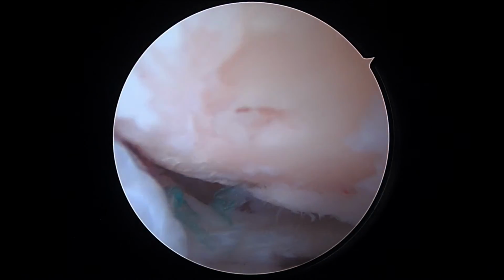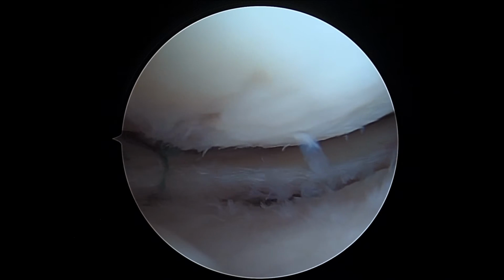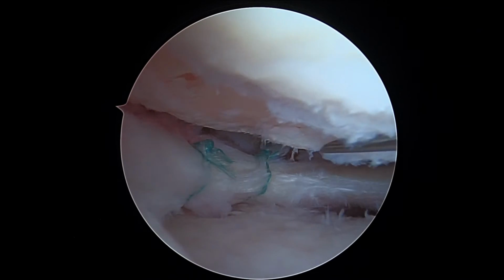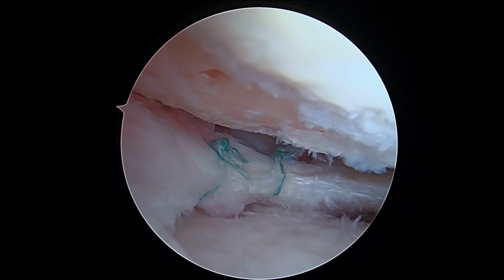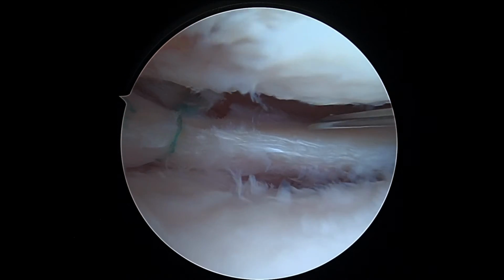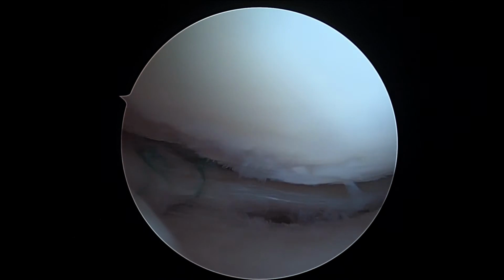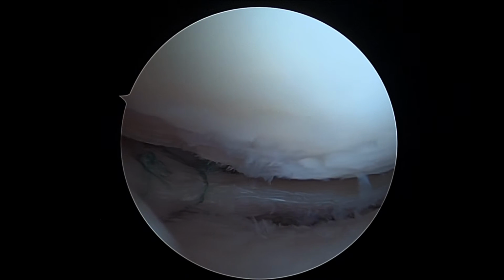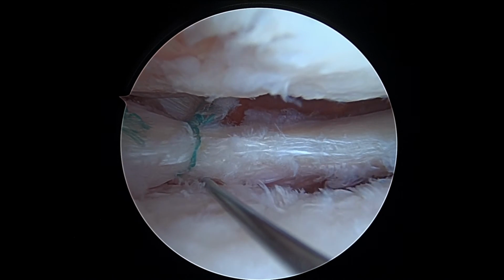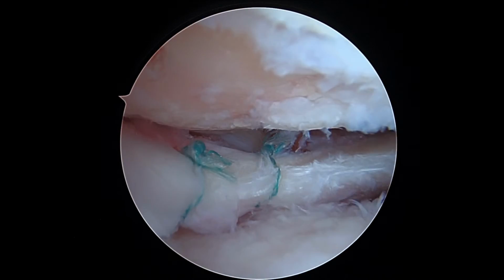Okay, so we've done a few little microfractures, and now we're going to have a look at this meniscus and placing some PRP into it. I'm likely going to start in the back, and then I'm just checking my angle here. Okay, so we'll show you some more in just a minute.